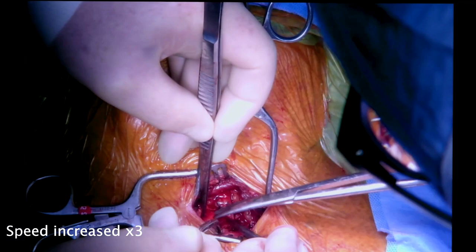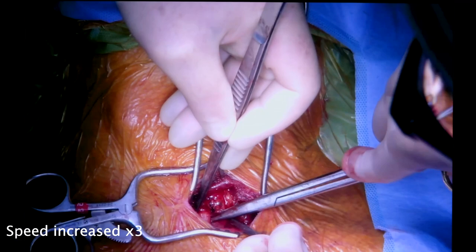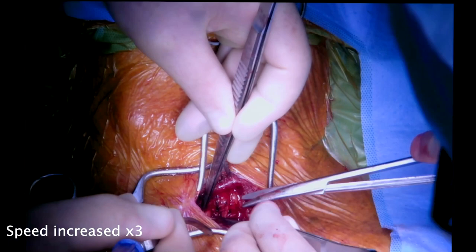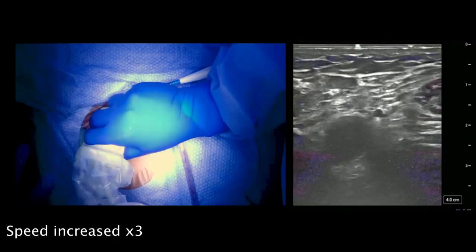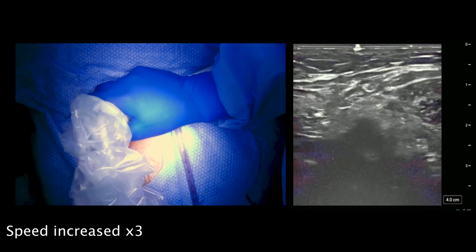Three centimeters of the common carotid artery was isolated and an umbilical tape was placed around the proximal one-third of the common carotid artery. Then we pre-placed a U-stitch with a 5-0 polypropylene suture to facilitate hemostasis upon arterial sheath removal.